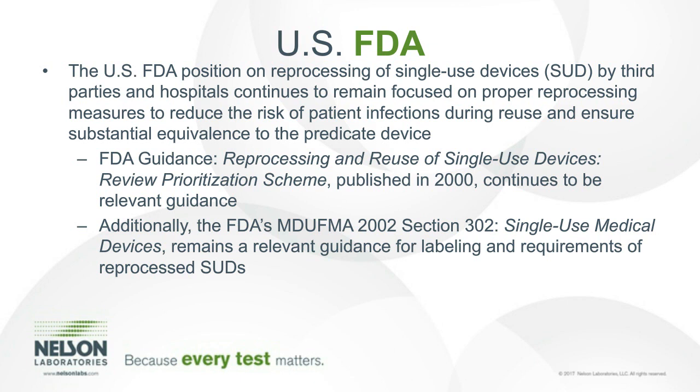Reprocessing of single-use devices is typically performed by third-party firms. For the remainder of this presentation, please note that for convenience's sake, if I use the word reprocessing, I am referring to the reprocessing of single-use devices by third-party entities. Current consensus estimates that approximately 20 to 30% of U.S. hospitals reported that they reuse at least one type of single-use device.